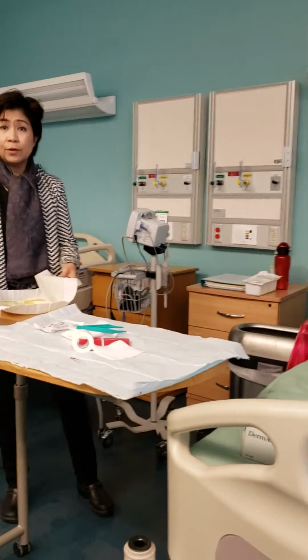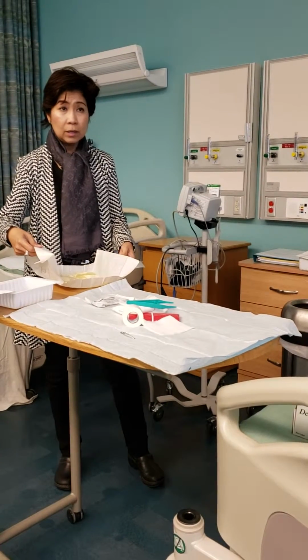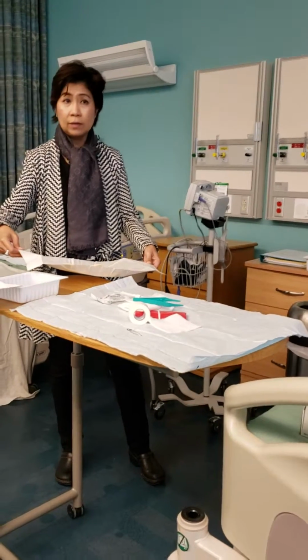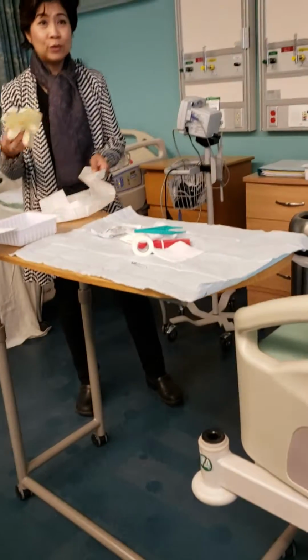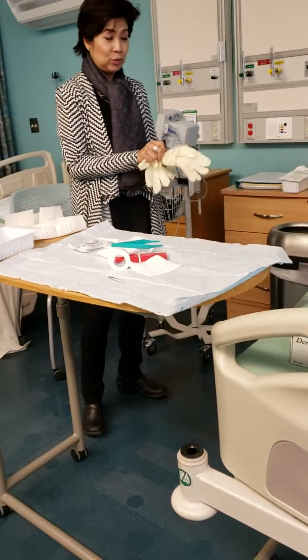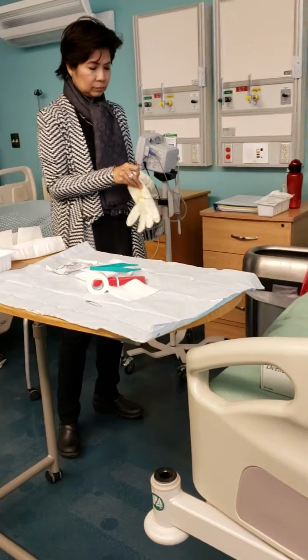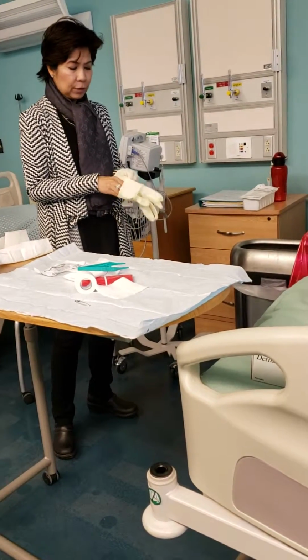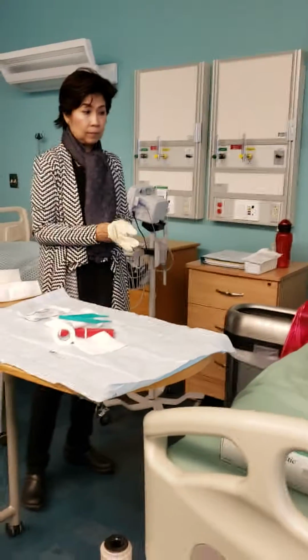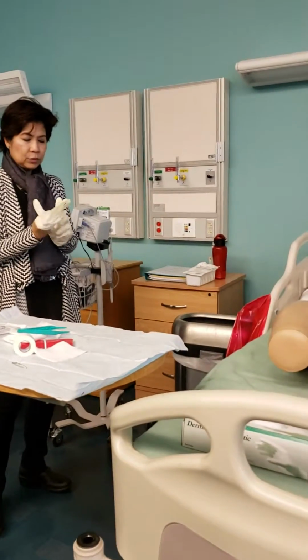This is the other scenario, where you don't have swab sticks, or the swab stick is not medicated. So go ahead and do your sterile gloving again. For the purposes of this demonstration, I put on my sterile gloves, but you don't do this, you do good sterile gloving. Once I have the sterile gloves on, I can touch anything in the sterile field. So you can do this in so many ways.